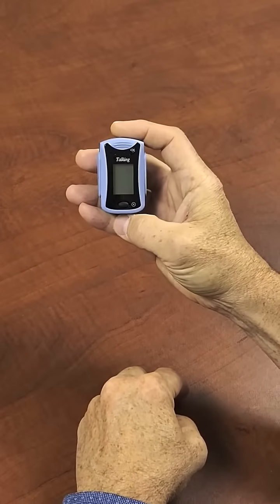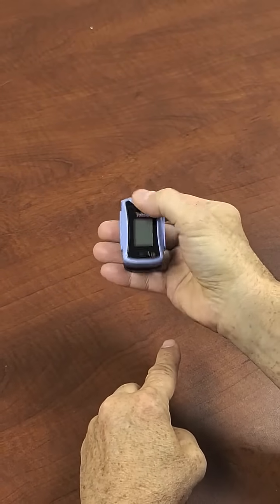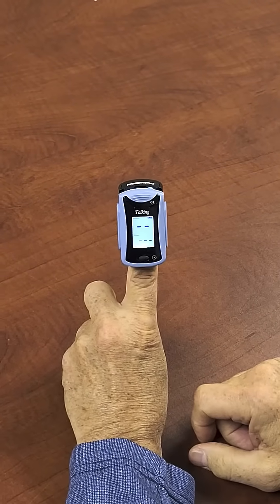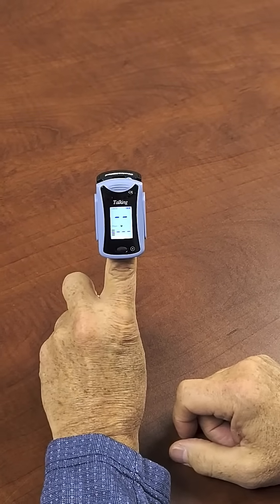This is the Concord fingertip talking pulse oximeter. To use it, we squeeze here a little bit to open it up, put our finger in, and press the button to turn it on. We wait for a reading, and you'll hear a beep when we get a reading.